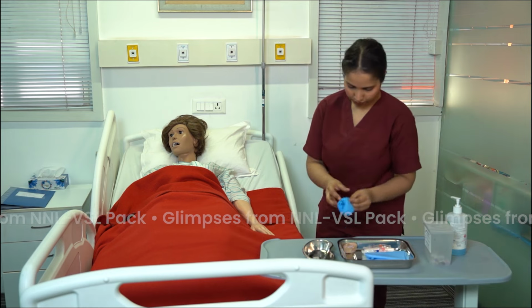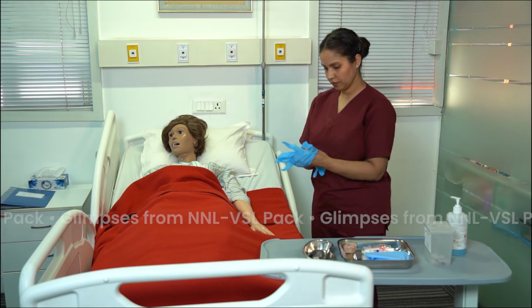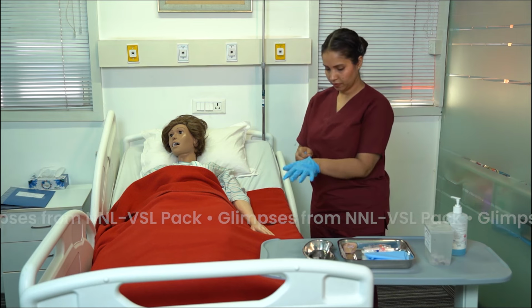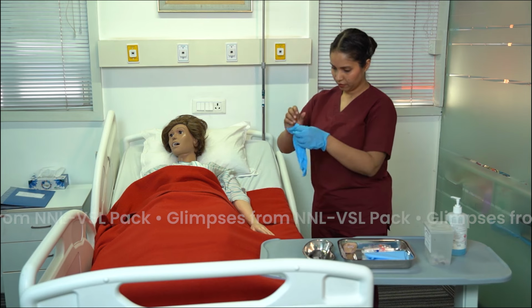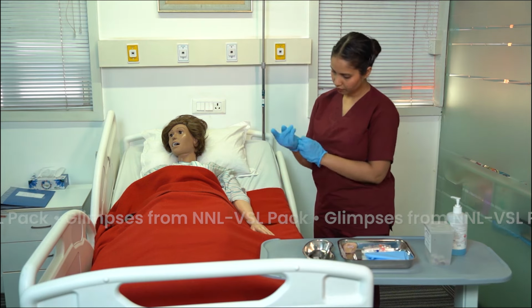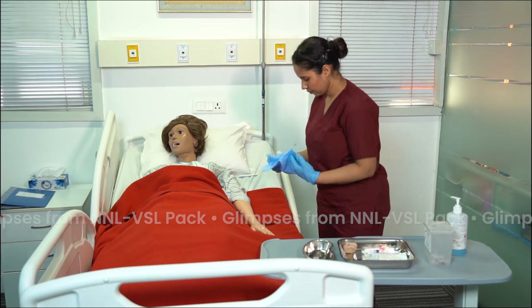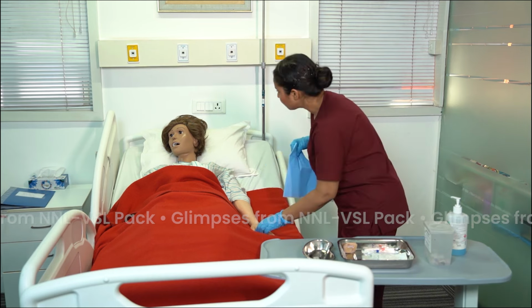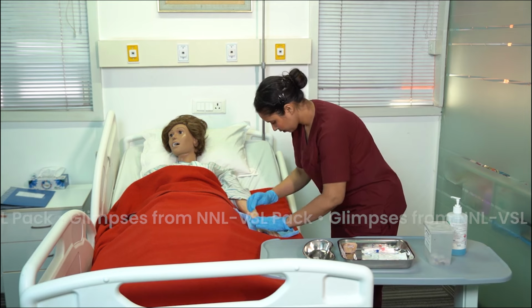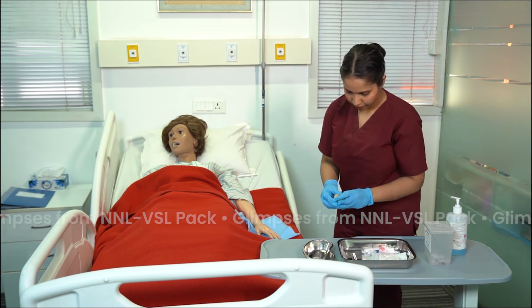Wear clean gloves. And put the drape sheet. Ma'am, can you please lift your hand? Thank you. Identify the vein. Apply tourniquet.